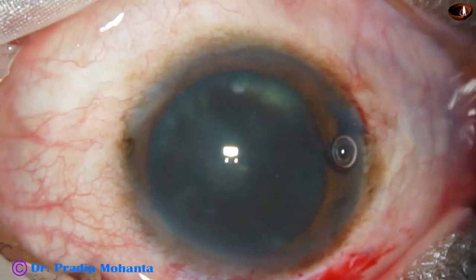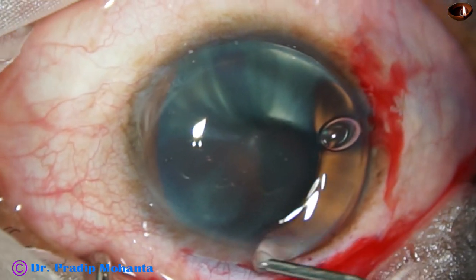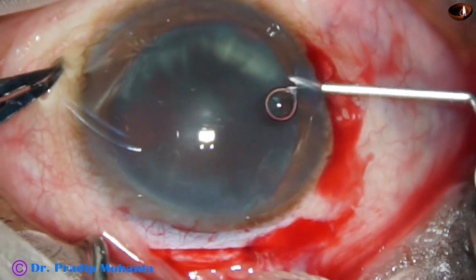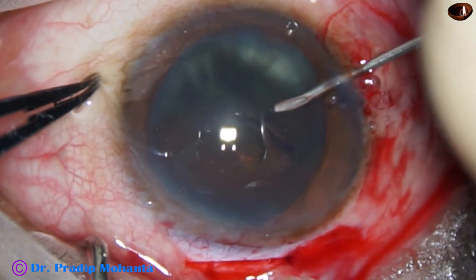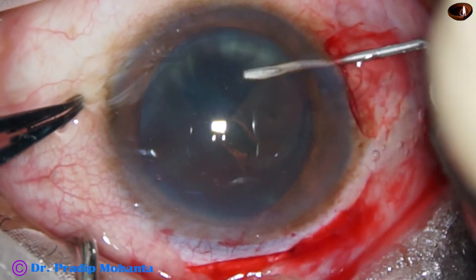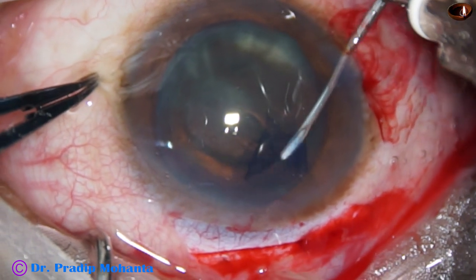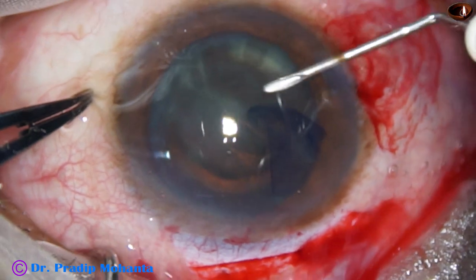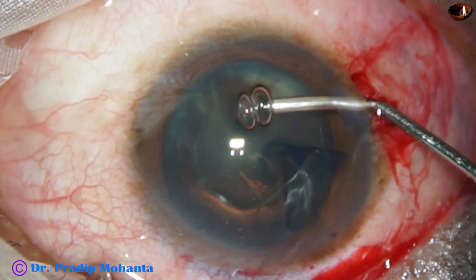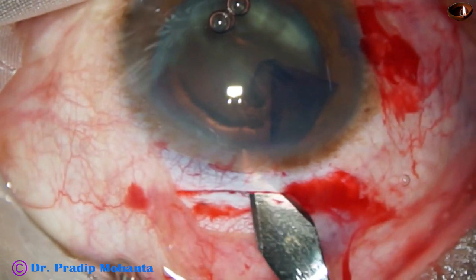Now I am going to do capsulorrhexis with the help of a 26-gauge bent needle. Viscoelastic on the ocular surface and cornea will improve visibility. The capsule has been incised and a capsular tag has been raised. The capsular tag is guided to achieve an adequate-sized rhexis. For SICS, the rhexis size should not be less than 5.5 mm — it should actually be 6 mm — because we have to prolapse the nucleus from the capsular bag. Now the tunnel is being opened; the corneal side is opened from one end to the other with the keratome.